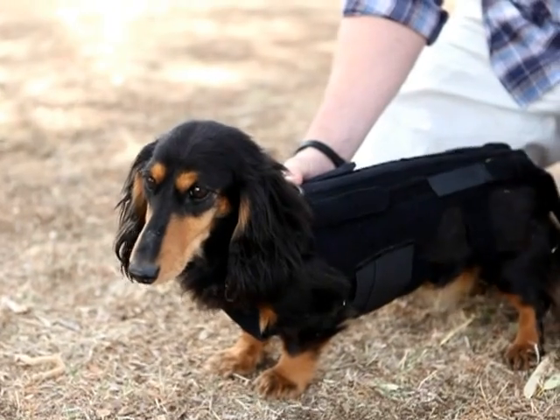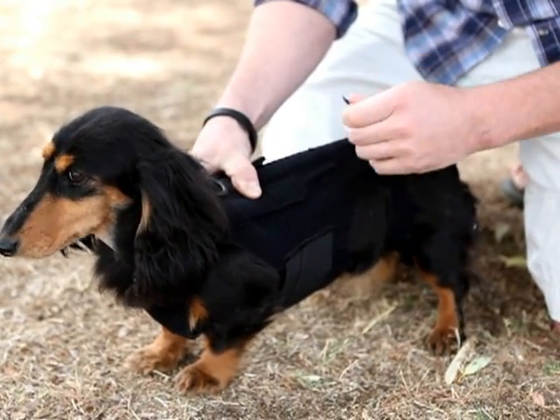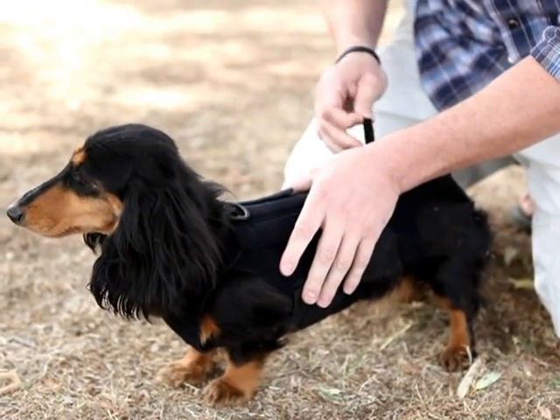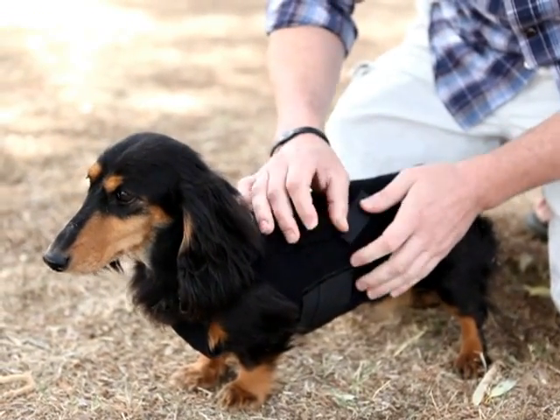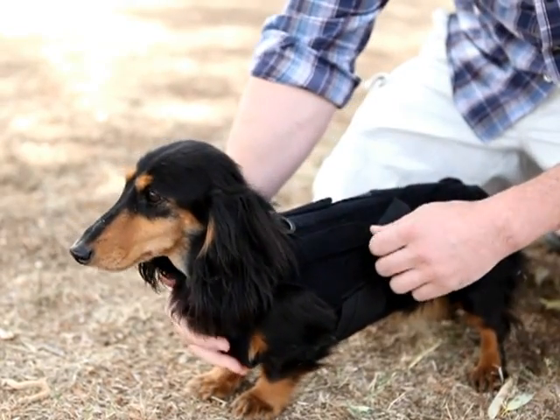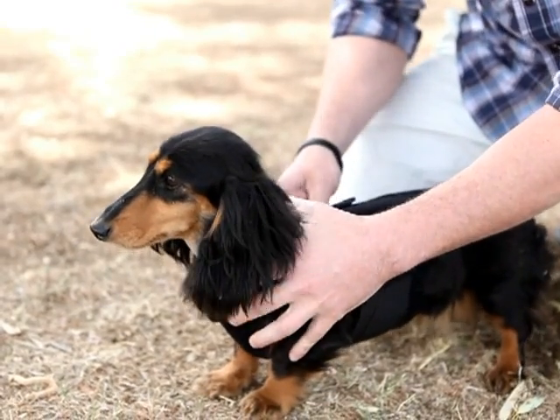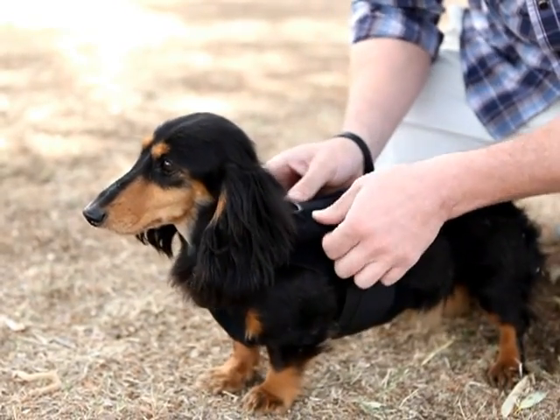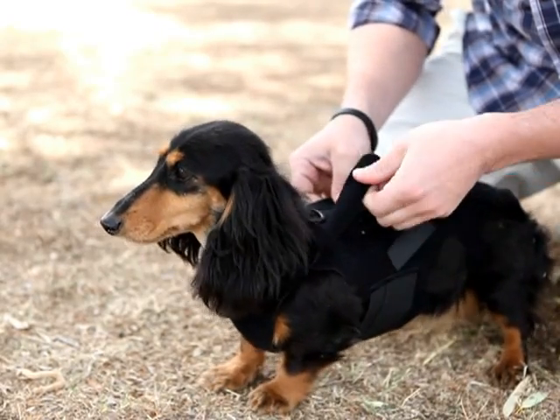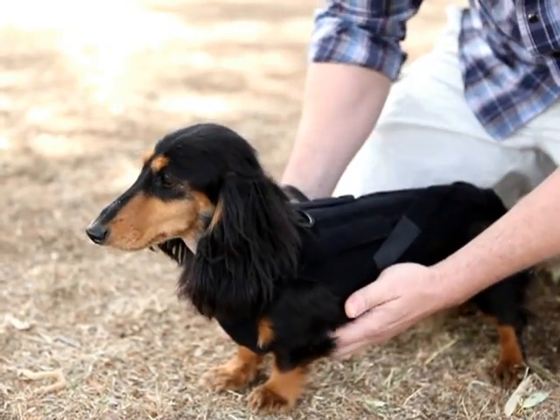And then the rear straps — see how they're loose here? We can tighten those up in various ways. We can go up or we can criss-cross them. You want to make these snug but not too snug to where it's cutting off support, but these guys are a little wiggly. You can even criss-cross the front ones if you want to, but on her it doesn't look like we need to.